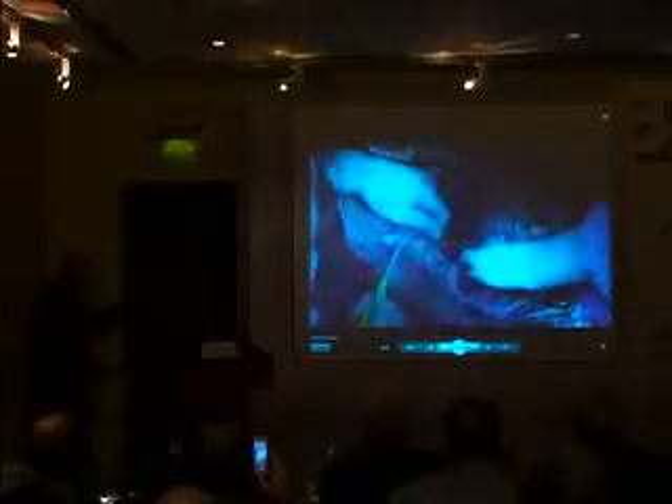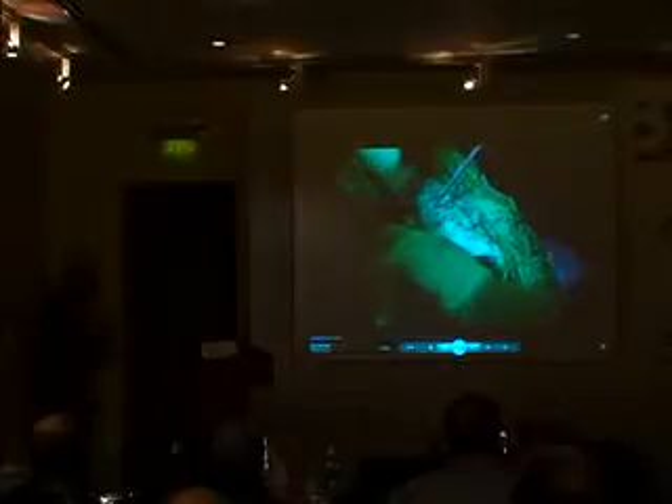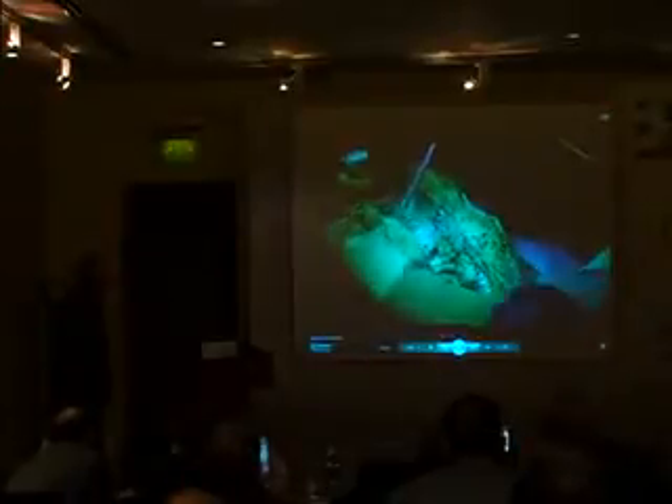You can see here how I'm dissecting. It's a little bit like painting with watercolors — you only know where you're going by where you've been. Putting a lot of traction on the peritoneum here, and just laying this electrosurgical ball tip on pure cut right at the interface of the peritoneum.